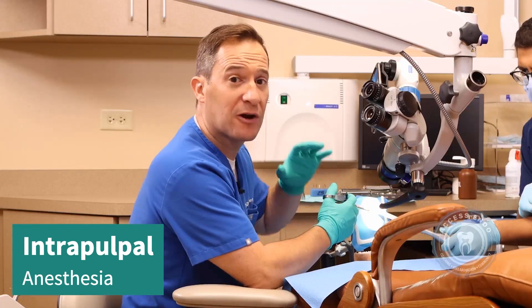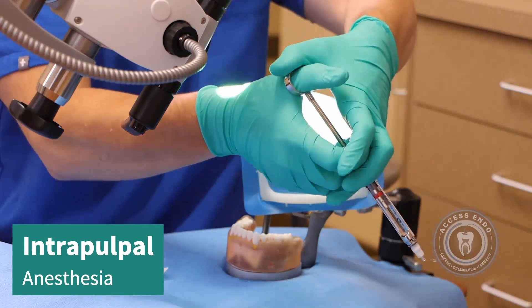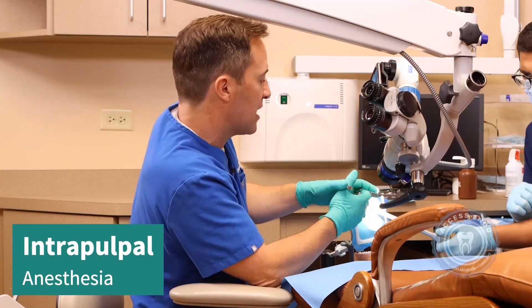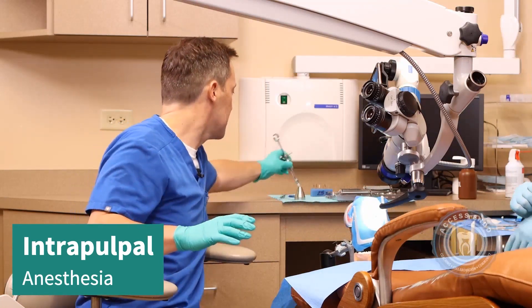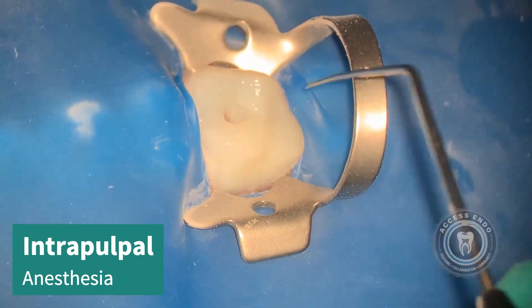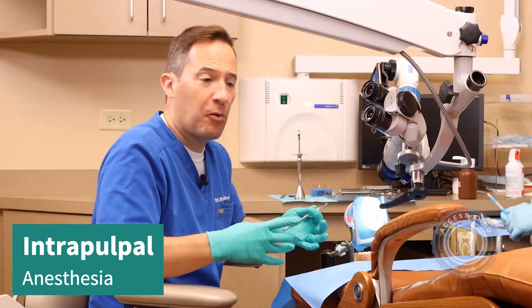I'm going to say, okay, on three you're going to feel me for just a second, and then everything's going to disappear. I personally like to bring my left hand over like this. I used to only do it with my right thumb, but I've developed a little bit of an issue with my right thumb, so I'm going to bring both thumbs over — it's going to allow me to give a good amount of pressure. I bring it in into the chamber, feel it sort of sink in, and then bring both thumbs over. I tell them on three: one, two, three — and you give pressure. That's going to really take the numbness to the next level. Always go back and confirm with the patient that they feel better. Sometimes I'll be a little more aggressive to make sure the patient's fine. The intrapulpal is huge — it's most effective when you haven't completely unroofed the chamber, because it allows that pressure to be exerted across the entire pulpal tissue.